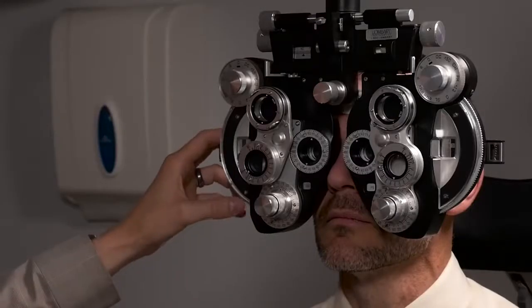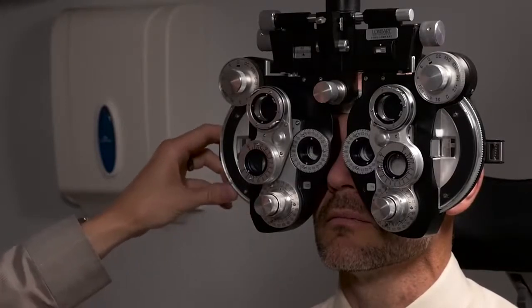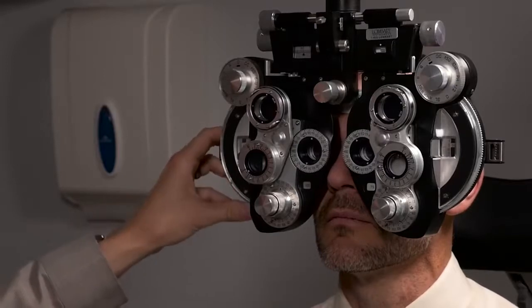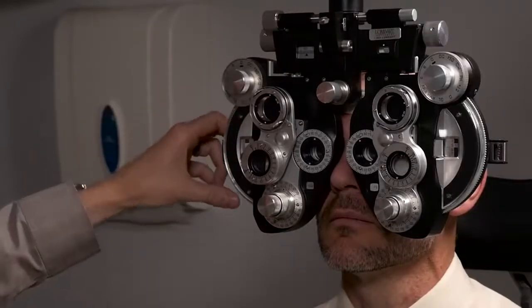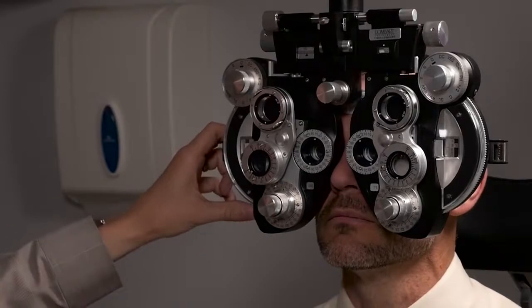I have displayed the 20-30 line, which is a good line to begin refining your refraction. I'm slowly adding more minus to his prescription. Right when he says 'about there,' you know that you need to add another 0.5 to 0.75 more minus, and that's going to be in the ballpark of the prescription. I'm continuing to refine the sphere — the sphere is on this side of the phoropter — to get as close as we can before I start refining the cylinder component of his prescription.